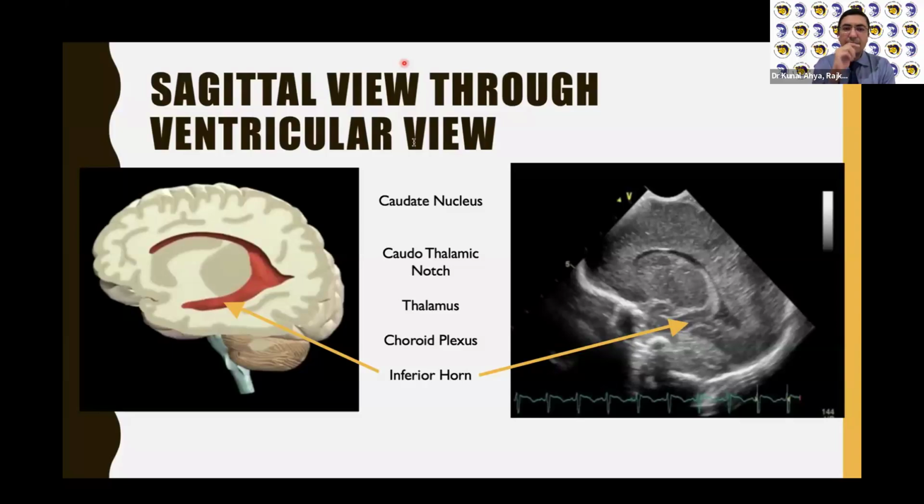So basically, periventricular leukomalacia is usually seen in babies who are preterm, or sometimes in very severe hypoxic babies who are full term also. Usually you see it on the coronal plane. If you see in the initial days a hyperechoic area, that is the periventricular flare, that is the hyperdense area extending beyond the lateral ventricles in the coronal view, like a fan-shaped structure.